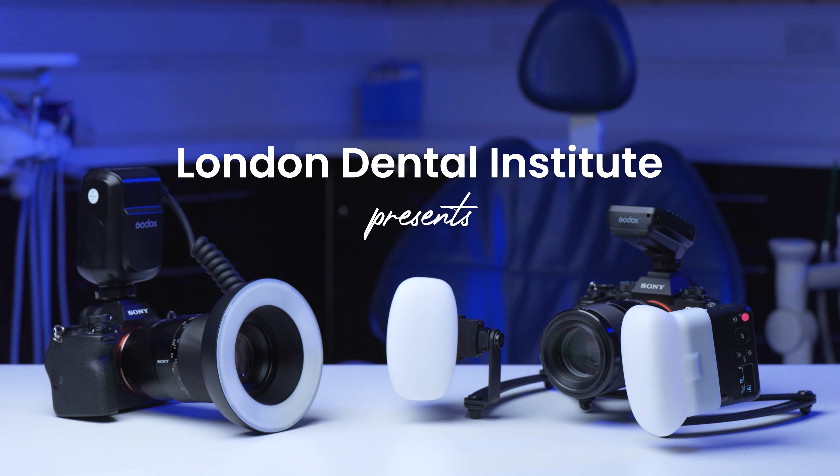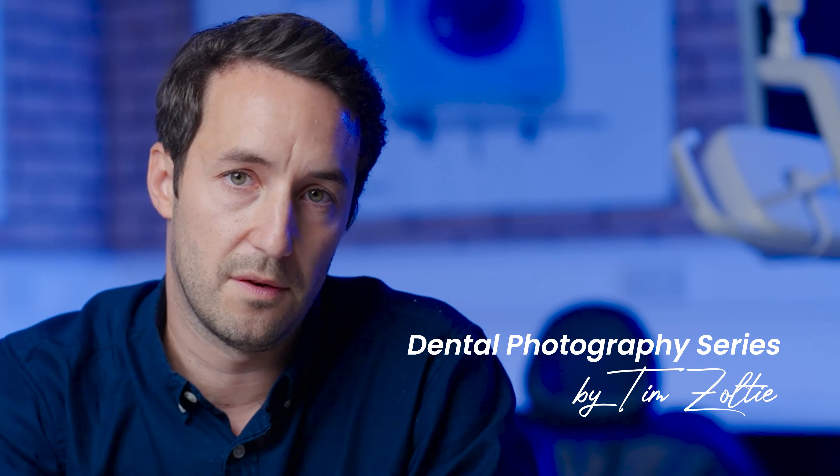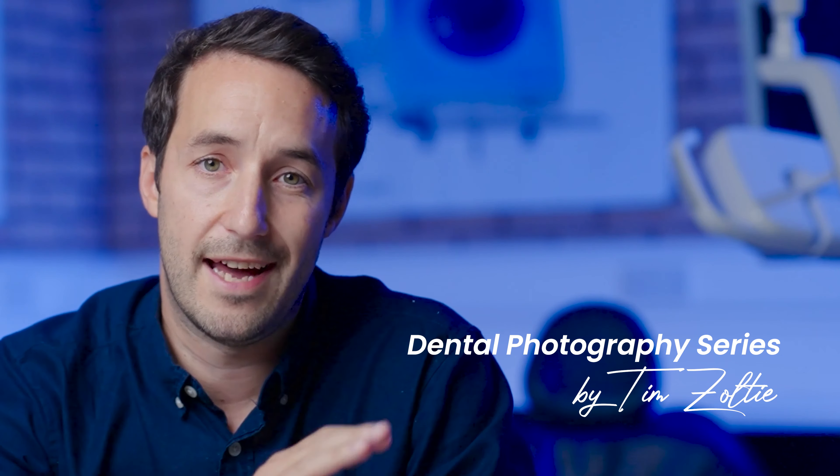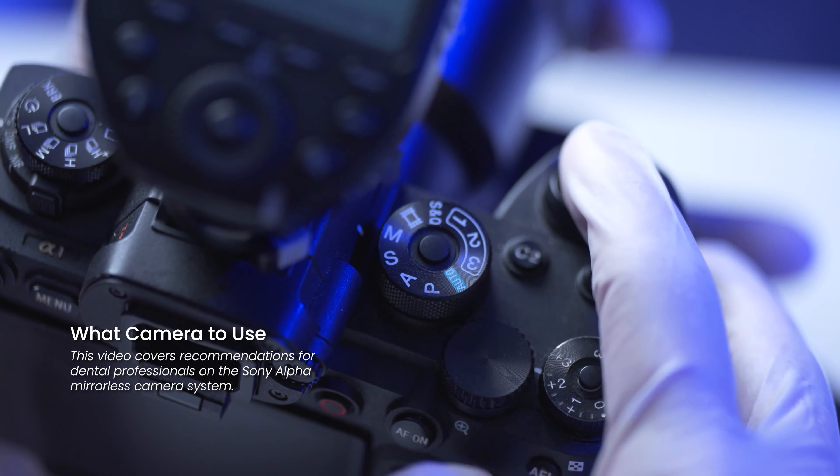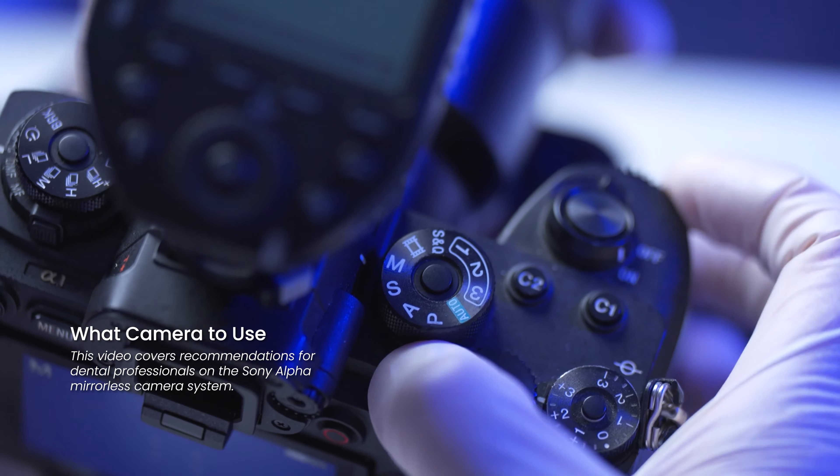One of the hardest parts of dental photography — and one of the most important — is accurate color reproduction. This is extremely important in dental photography. I can set up my exposure settings for intro photography and store them as a preset under custom one.